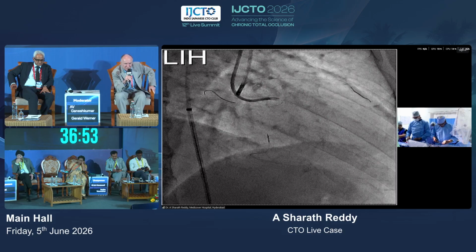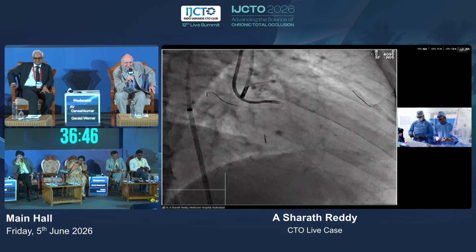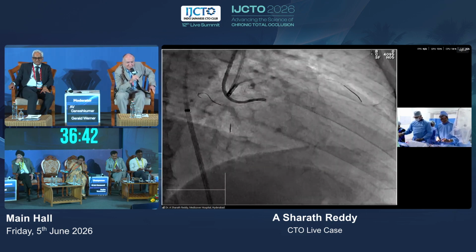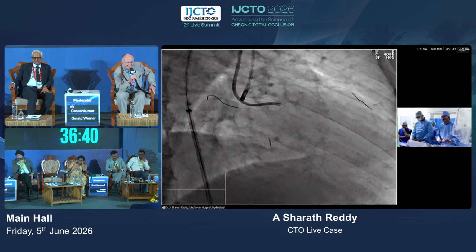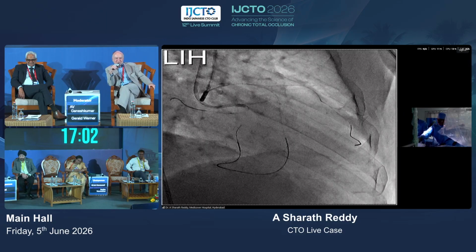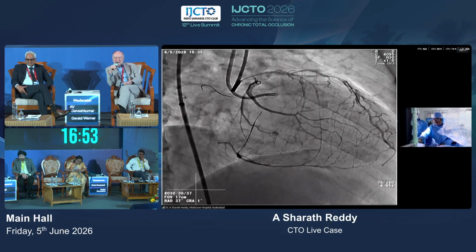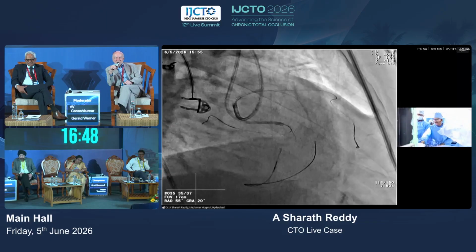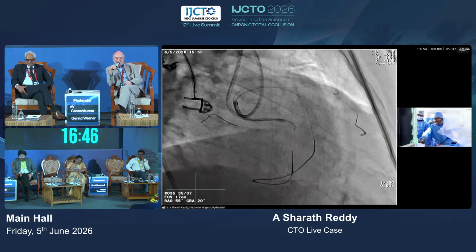While you proceed, we watch you on the second screen because there is some progress with the gladiators. Or is there? The image doesn't look like progress. No progress. So please prepare antegrade. Yes, I have been in these situations many, many times, and I know. Yeah, I came back to antegrade.